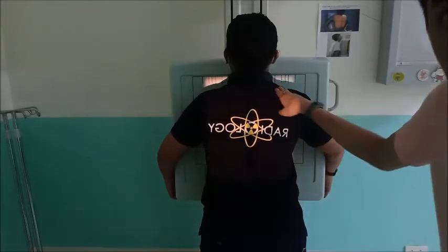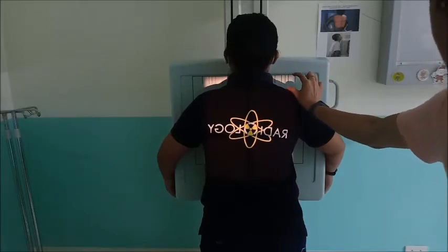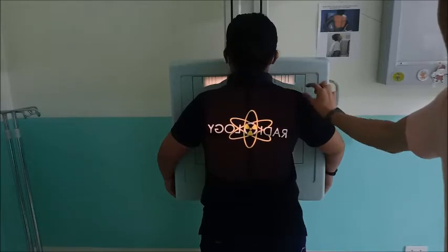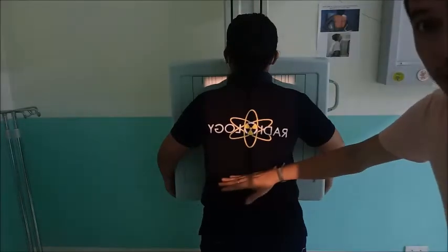So that means it covers the apex of the lungs. In the radiograph, you will see a little border in the shoulder area, and also the inferior portion down to here, where the lungs of this patient extend.